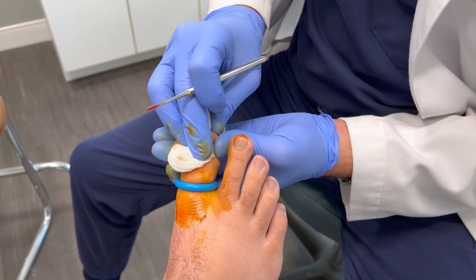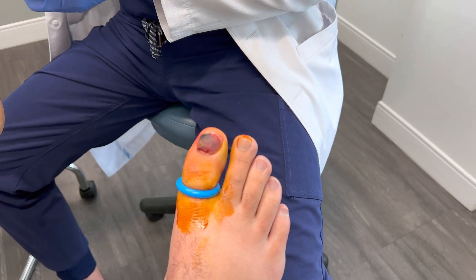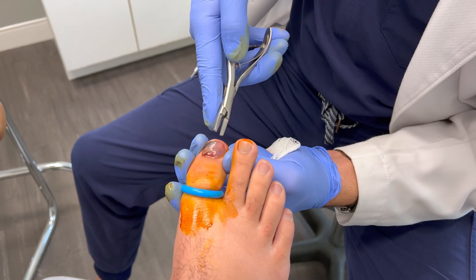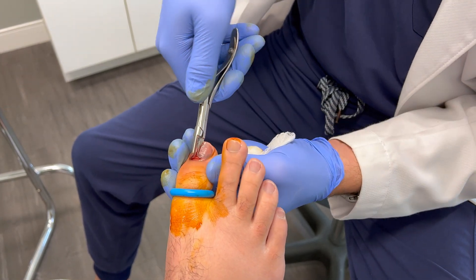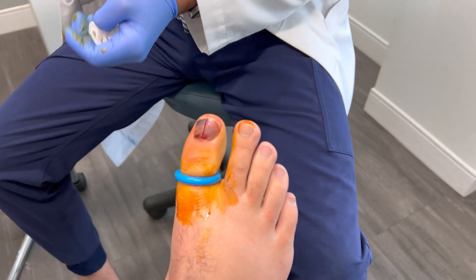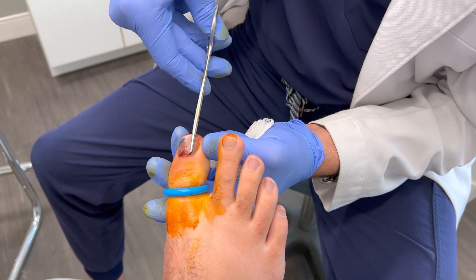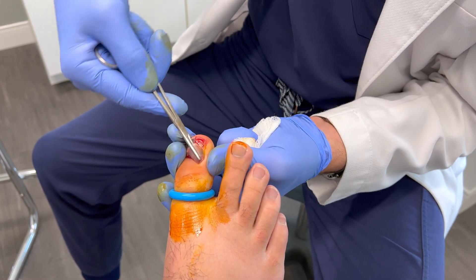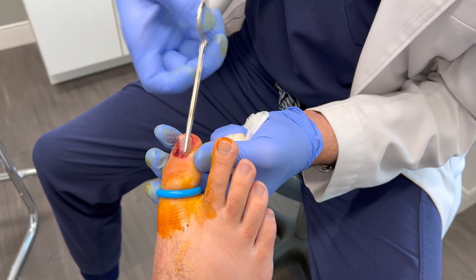The more proximal aspect of the nail is freed up as well. A trick that I learned for making it easier to remove the toenail is to just split it into two smaller pieces. Now with some gentle force, the toenail is removed from the remaining attachments of the nail folds.